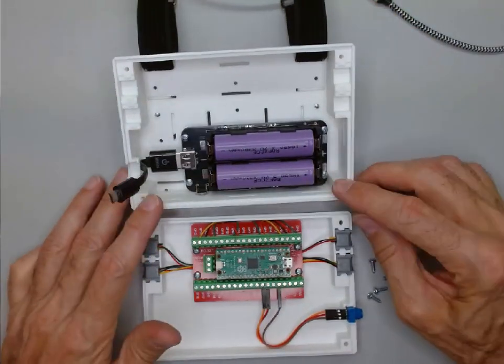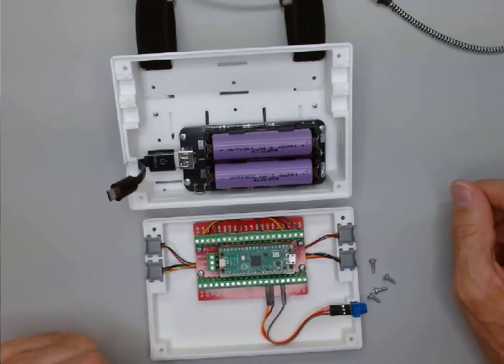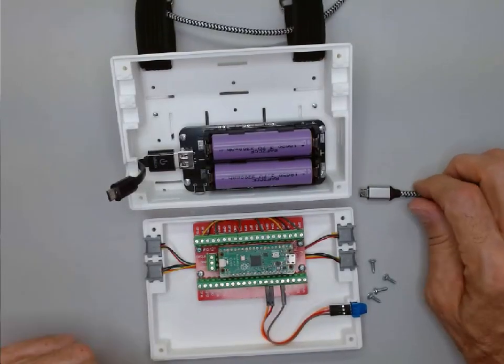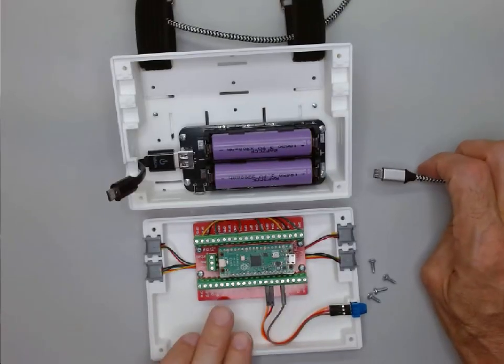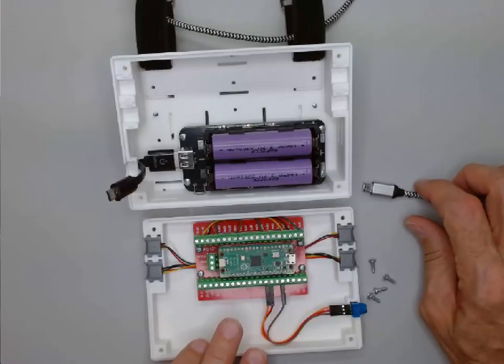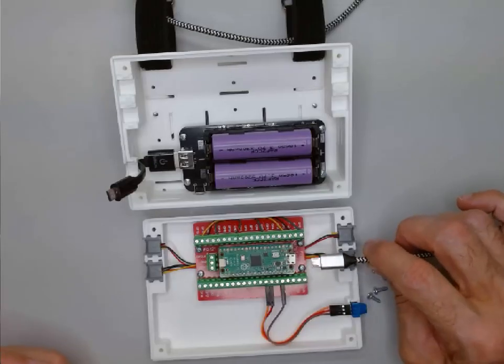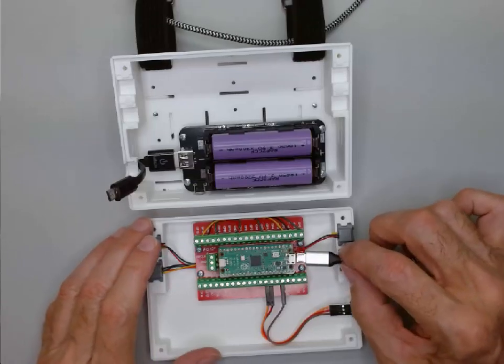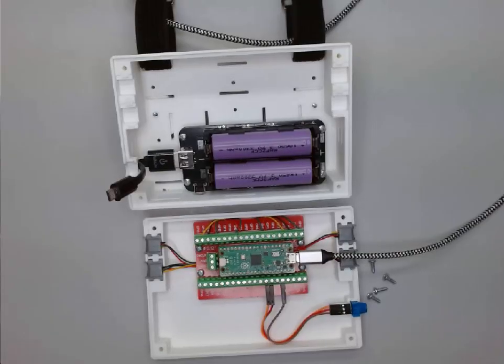The second part is we have run some software against the Pico just to test the assembly, or the wiring at least, of all the components. But we also need now to load the official Walker proximity sensor software onto this Pico, which means we're going to have to connect it again to a data cable, and can't do that once the unit is assembled. So we're going to do it right now. So I'll slide this in, and then we'll go over to Thonny and see what to do there.